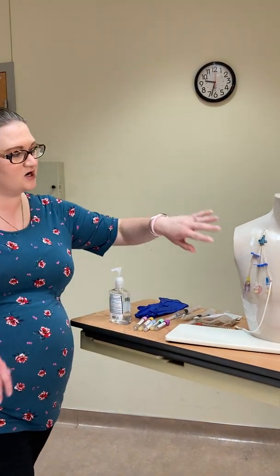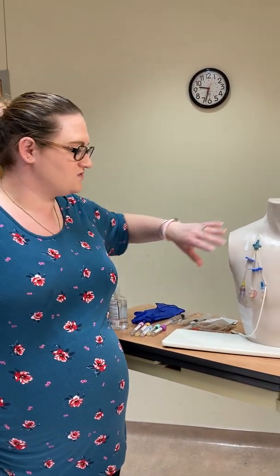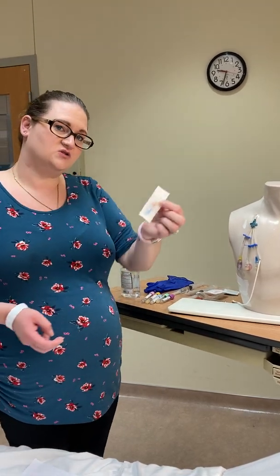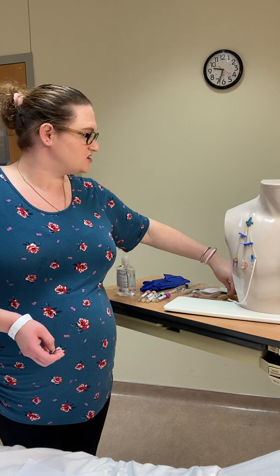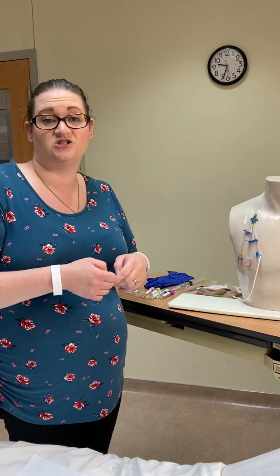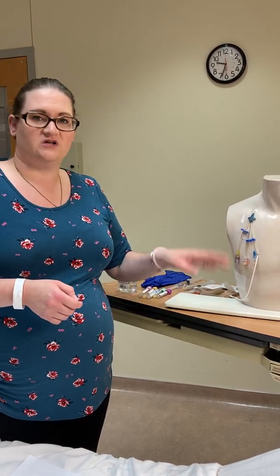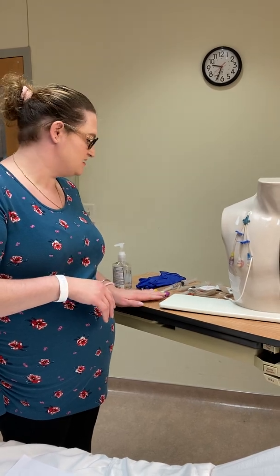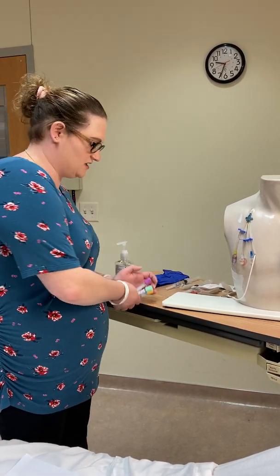Know your facility's policy for blood draws. Some require a flush before and after; many require 20 mls of saline after drawing. Also know whether your facility requires a cap change with every blood draw. For certain patient populations, frequent cap changes increase infection risk, particularly when blood draws are done very frequently.